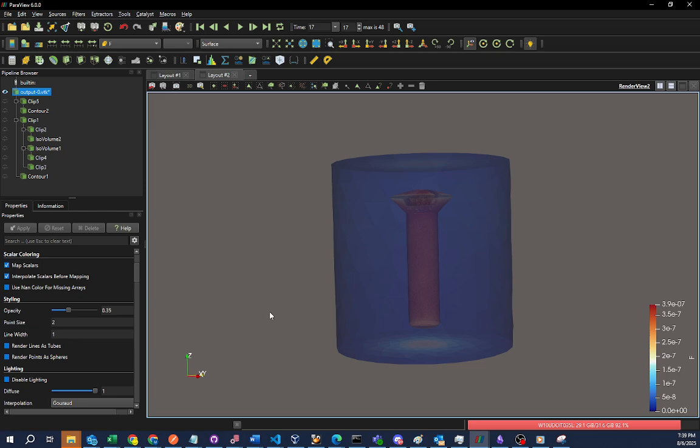The degradation of a screw is essentially just a screw inside a solution, and over time you'll see that the screw gets degraded by fluorine and chlorine. The screw is made out of magnesium, and you'll see that the magnesium in the screw will be diffused out. So let's just go into it.